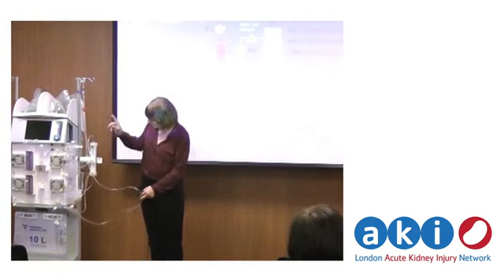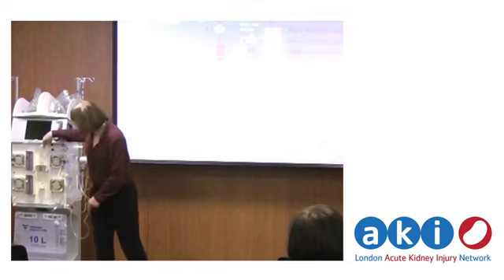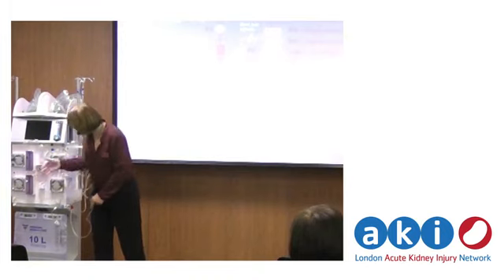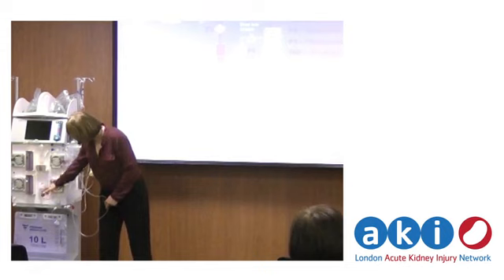I've set this up, or Rex sets this up, in dialysis mode. Coming out now is coloured blue. This is the return line now, going along here through the bubble trap with the air detector here. This is an optical detector that detects when prime fluid, the clear saline that you prime with, has changed to blood, so it tells you when the circuit is virtually filled with blood and you can start treatment.